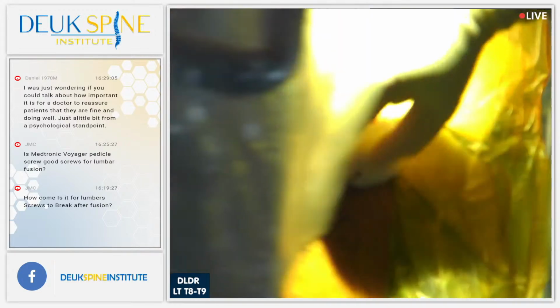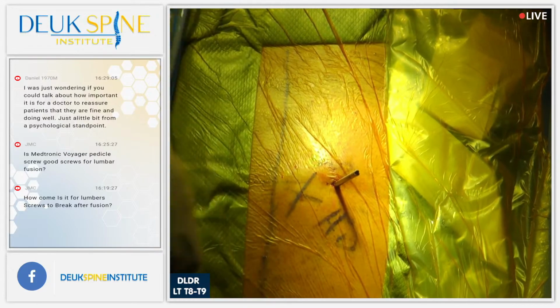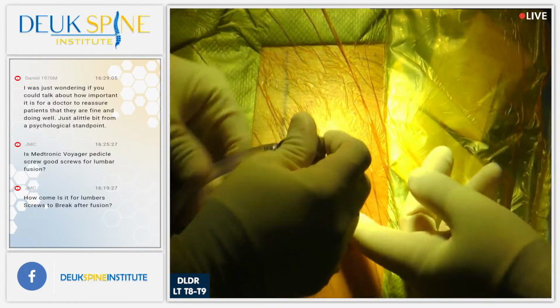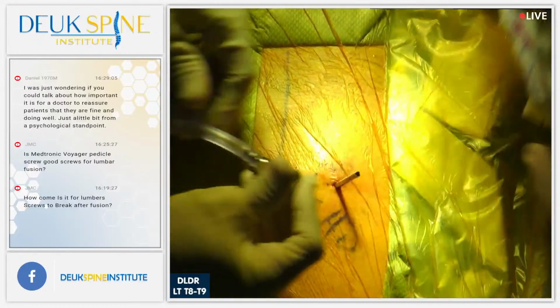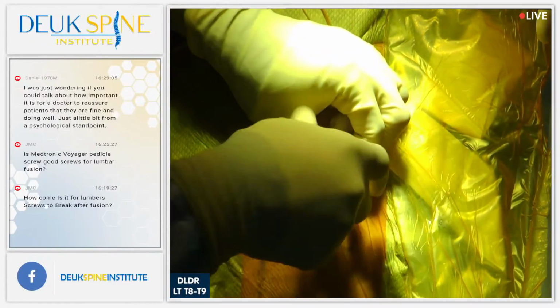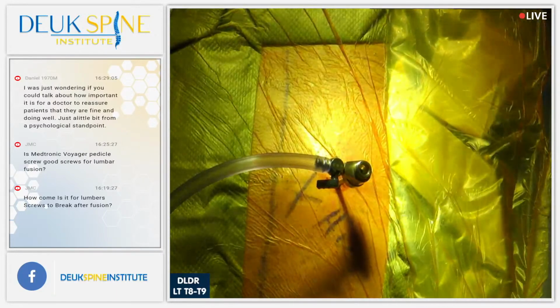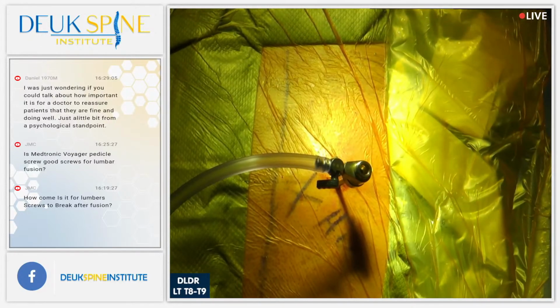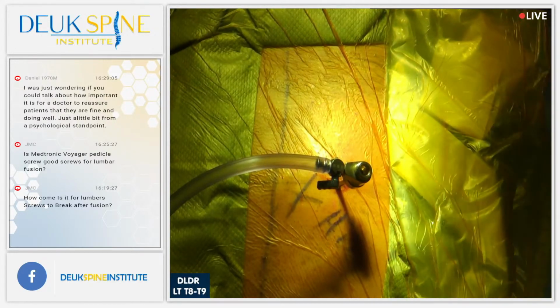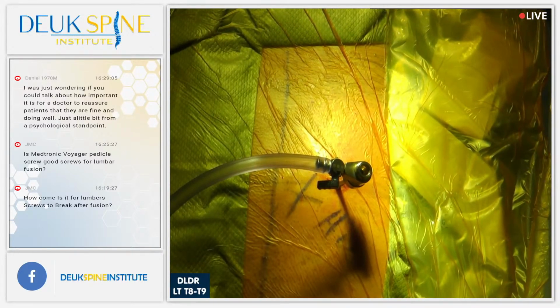Any questions? Yes, these next 2 come from JMC on YouTube. By the way, we've lost 1 drop of blood. Here it is. Kind of splurted it around, but essentially 1 drop of blood. So this is bloodless surgery. There's no removing lamina or foraminotomy. There's no moving the heart over, taking ribs out, doing a costotransversectomy or a transpedicular approach. It's very safe.